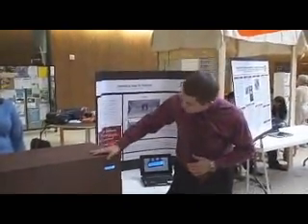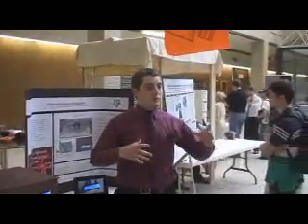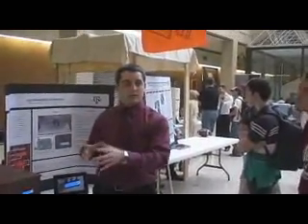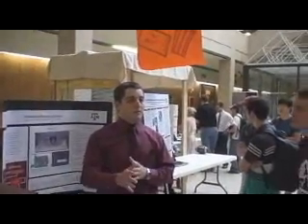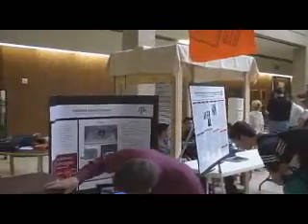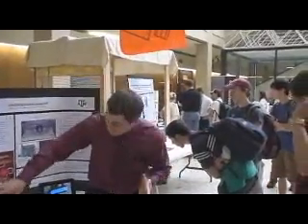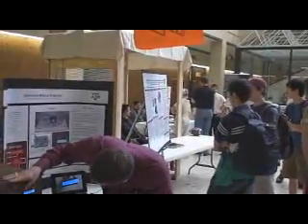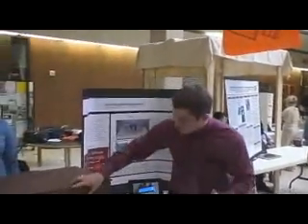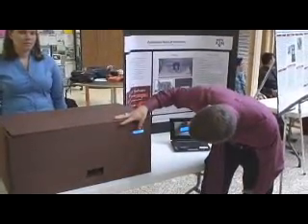And then you can set how many doses you want. So for each time, you can set up to 6 pills to come out. Does that make sense? For each dose. So this one we'll turn it on, and then we'll say 3 pills for pill 1. And we'll set the other one on, we'll say 2 pills. And then at 12:30.